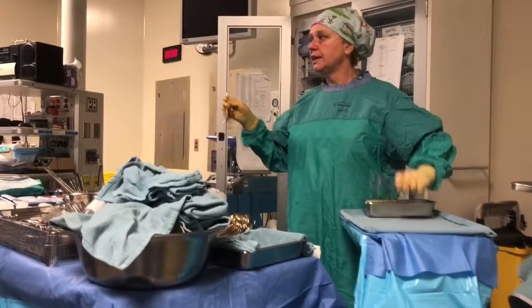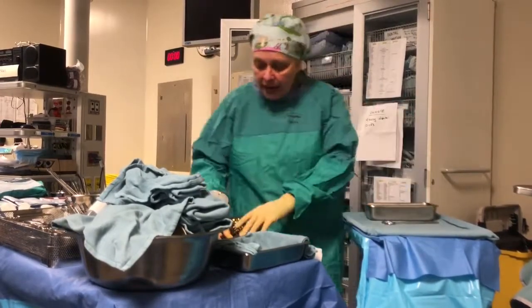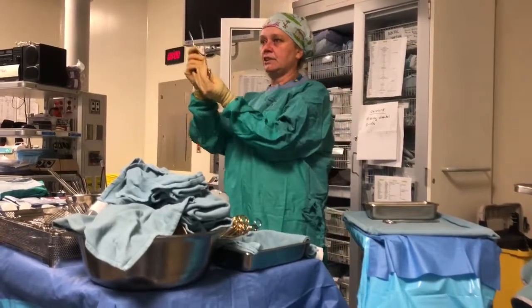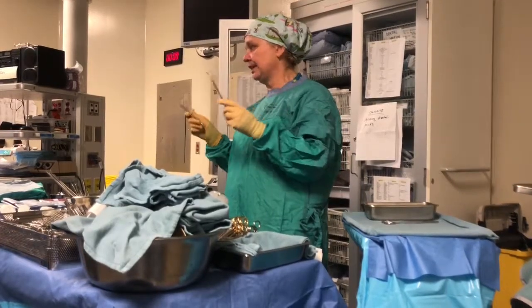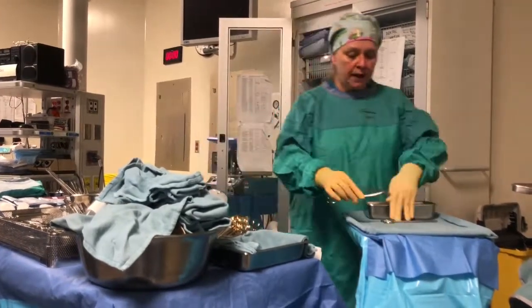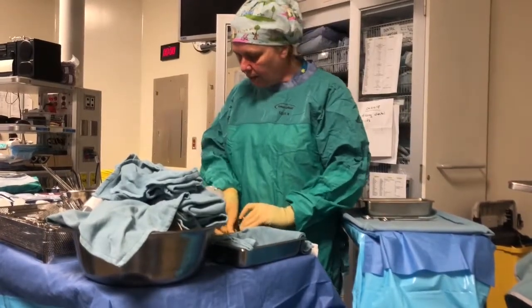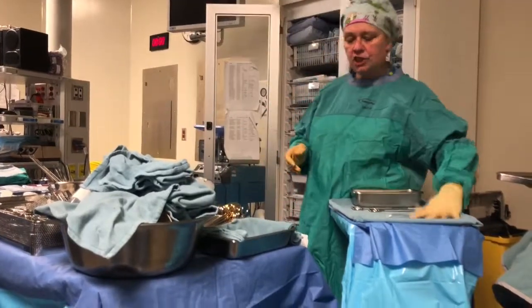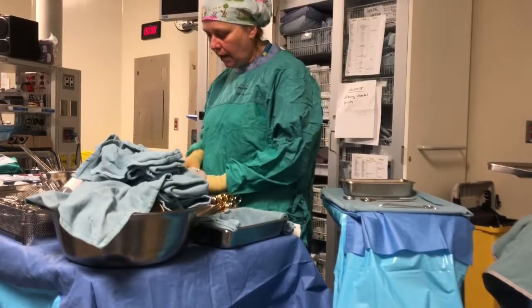These are for sutures. This is for tissue, heavy tissue, right? And the mets are for a lighter tissue, right? You can see the difference, right? We're just kind of reviewing. I know you guys have learned all this, but we're reviewing, okay? So I would have my heavy up, right? I would have a Kelly up to hold my suction and stuff, for sure.